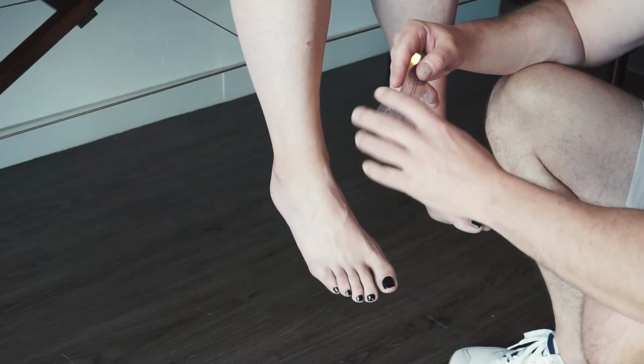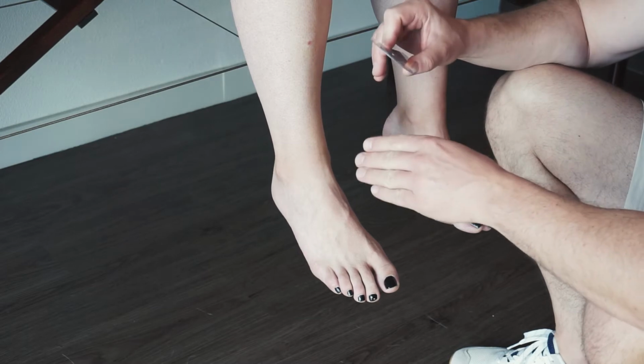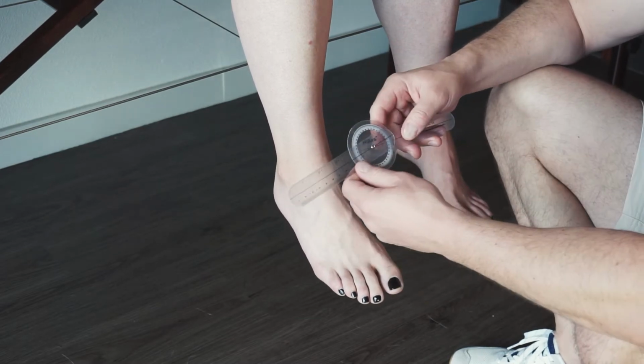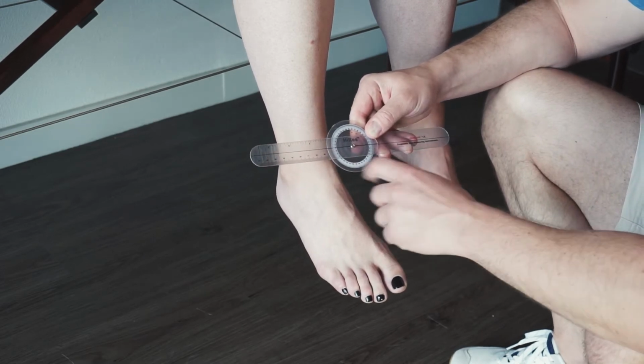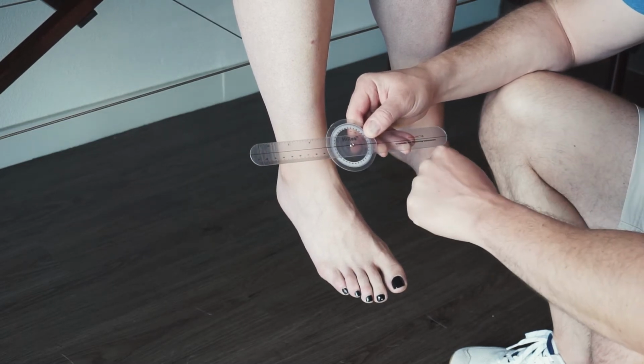Right, so this video is going to be the goniometric measurements for the ankle. We're going to start with subtalar inversion and eversion. For that, you must use the smaller goniometer, okay? And also, points on the practical will actually matter which arm is lined up. So there's going to be a proximal and distal arm.